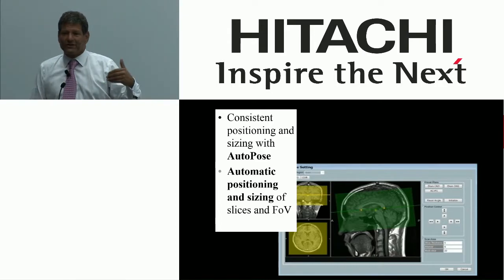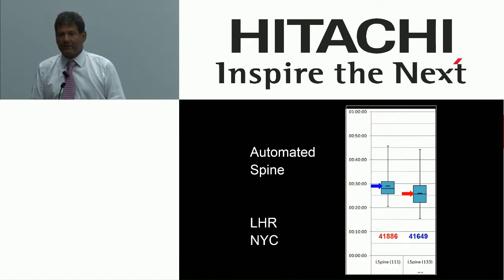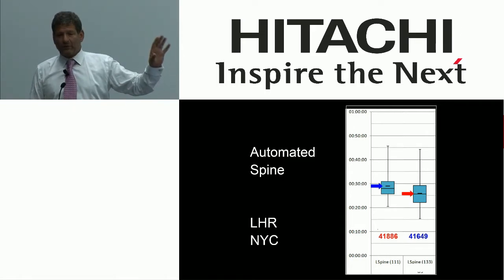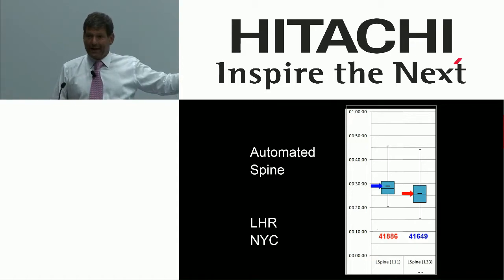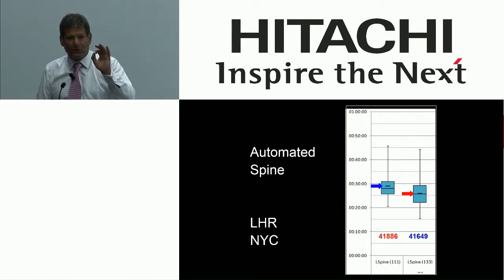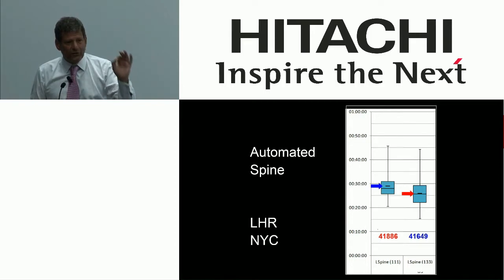And mind you, it's not just the brain. The brain is entry level. Here's some work on one of our scanners that has a spine automatic scanning protocol. And you can see these are the same machine. On one case, we bought the automatic positioning protocol. On another case, in the same neighborhood, we didn't buy the positioning protocol, and you can see that one of them has a slightly longer exam time, maybe 2 minutes longer. That means over hundreds of exams, they're 2 minutes longer.